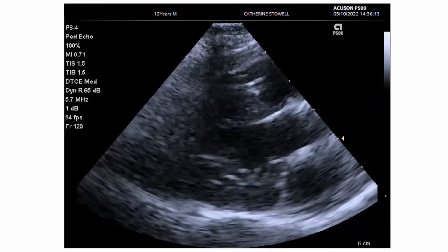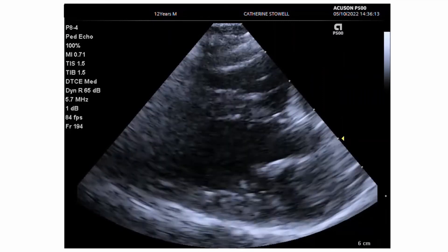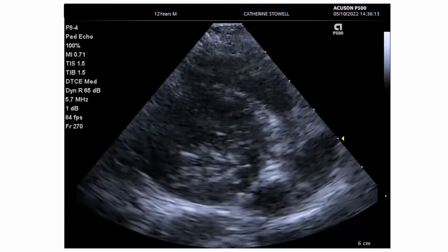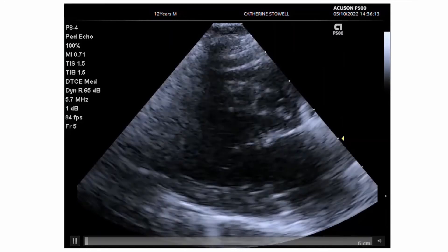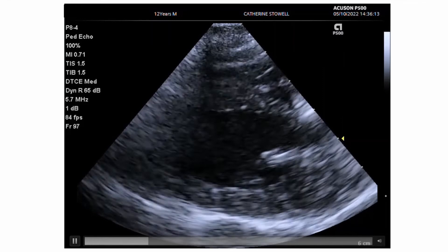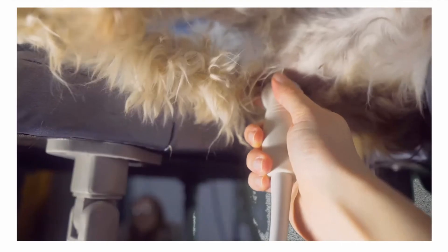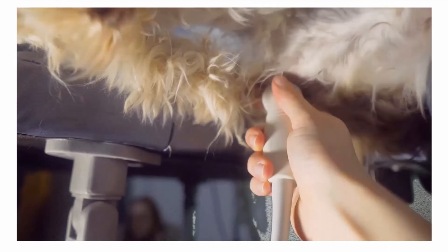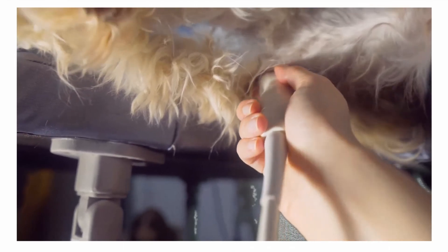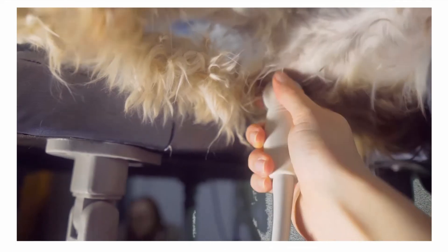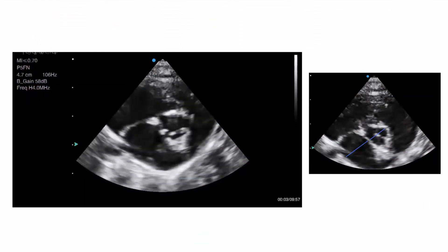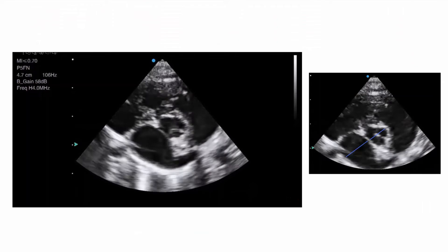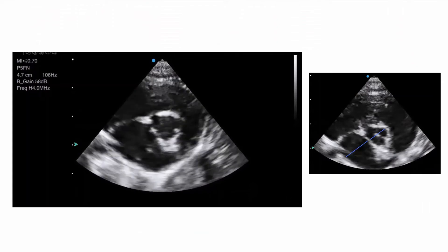So how do you get the short axis view of the left atrium? From your long axis, when you twist in place, you may find that you end up at papillary muscle level. What you need to do is tilt cranially from that position towards the base of the heart, and that will bring the aortic valve and the left atrium into view. This is a slow motion, slightly exaggerated video to show you that tilt up towards the base of the heart from papillary muscle level. When you've done that, you'll have this view — a very well known, much loved and much hated view that you would take the LAAO ratio from.